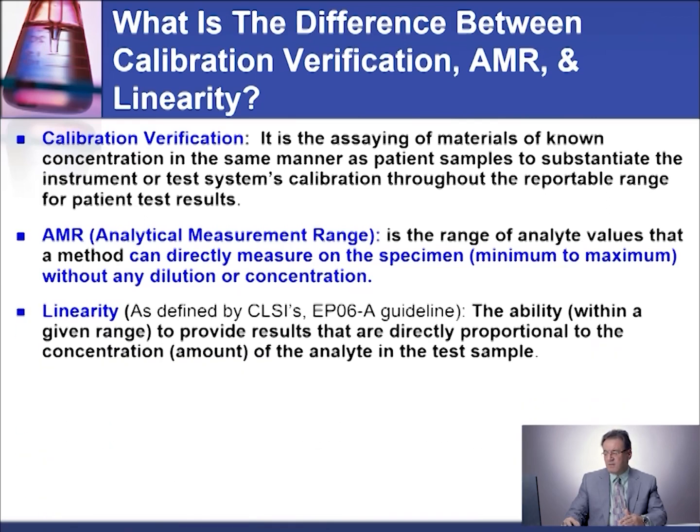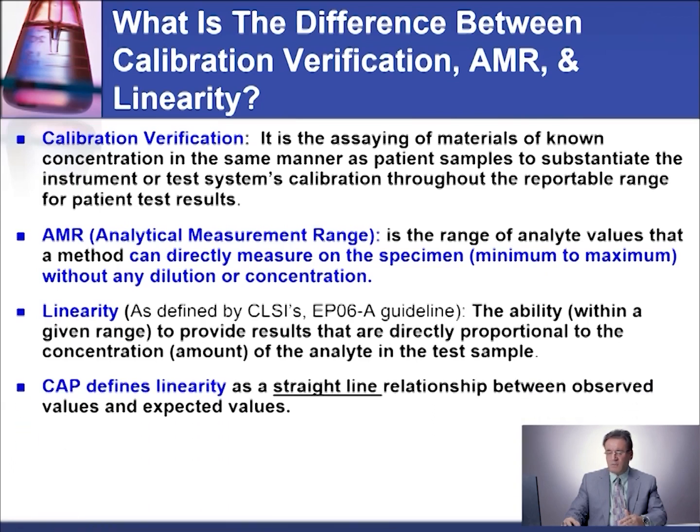Linearity is the ability to provide results that are directly proportional to the concentration of the analyte in the test sample. CAP defines linearity as a straight line relationship between observed values and expected values.